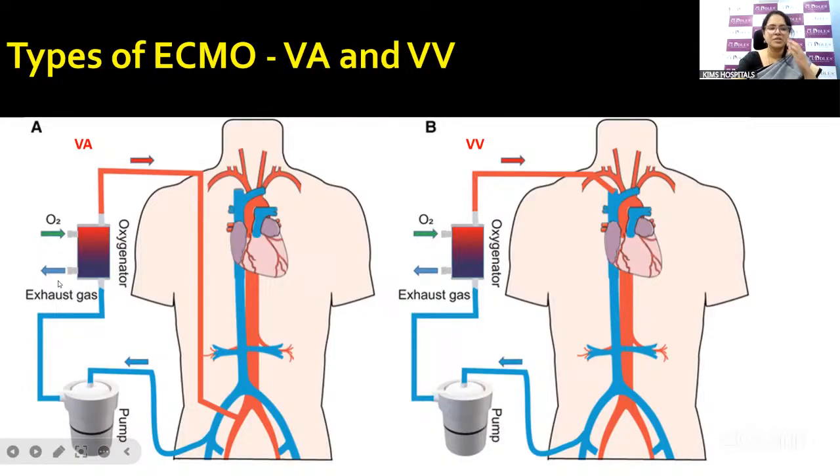And you can see in the oxygenator, you have a vent for oxygen entry and a vent for the exhaust gases to flow out of the oxygenator. We also have, of course, blood flowing in from the blue line and the oxygenated blood flowing out, the red color portion. And then you also have a water vent in and a water vent outside for maintaining the temperature of blood.